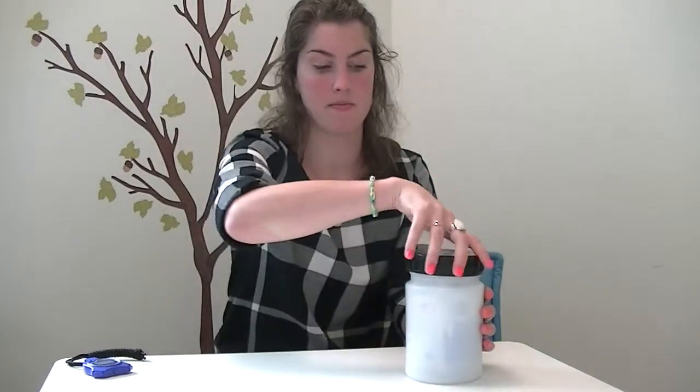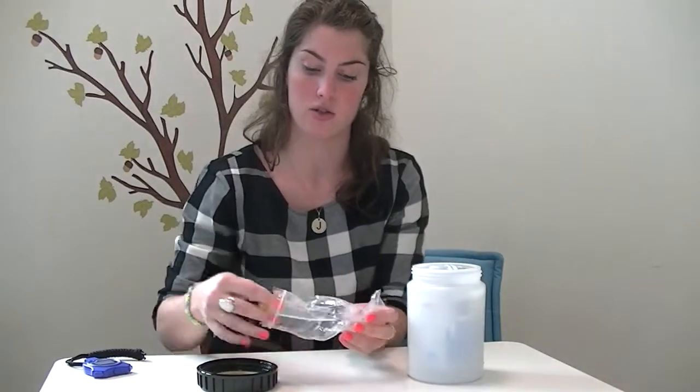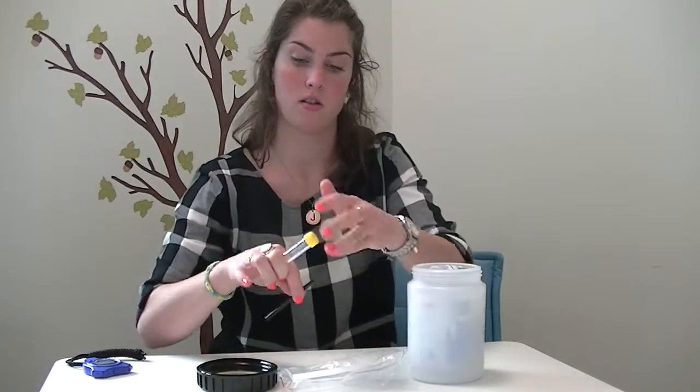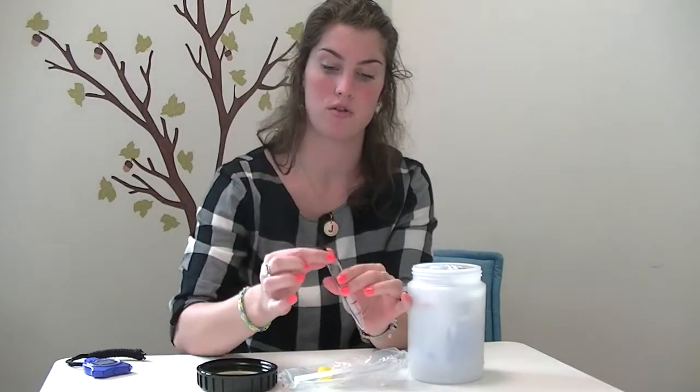Next, take your biobottle out of the freezer. Take out your Ziploc bag and from there, take out your straw and your tube. Take your straw out of the white paper. Take off your yellow lid and put your straw in the tube.